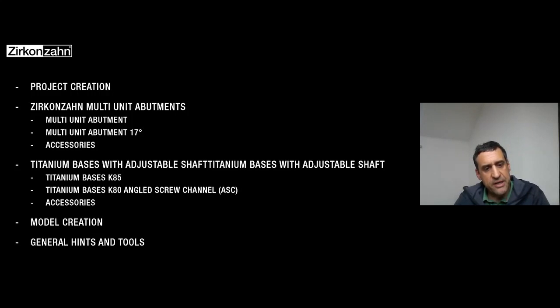So titanium bases, the K85, for example, is the new T-base, much higher than the regular one. And you can also cut this T-base at different levels, and I will show you in the software how to have a good fitting after you cut it.